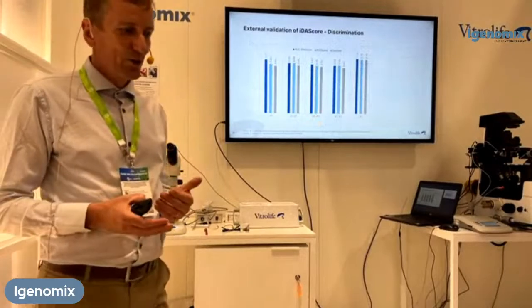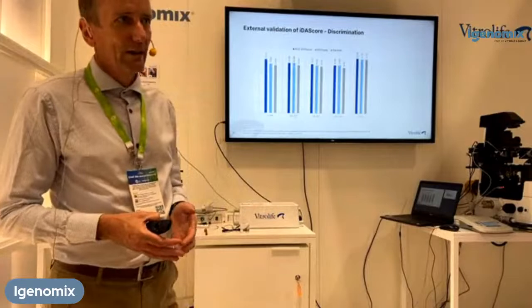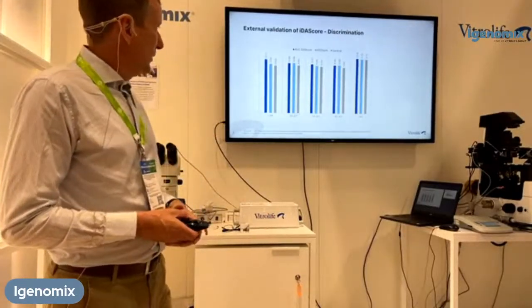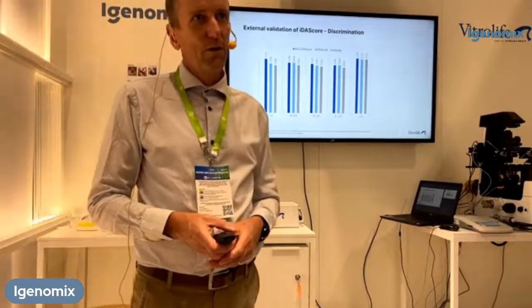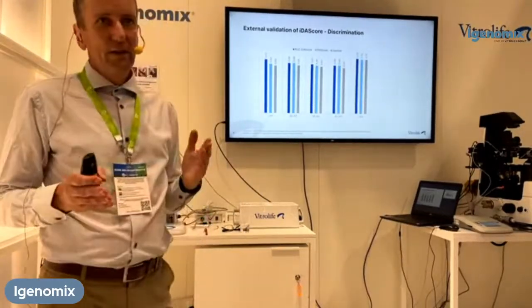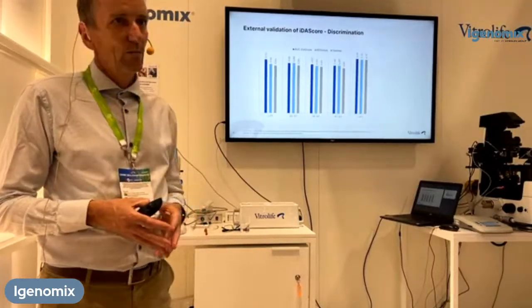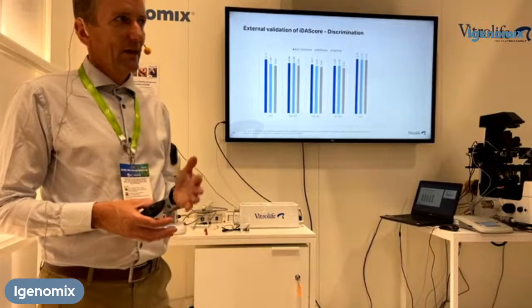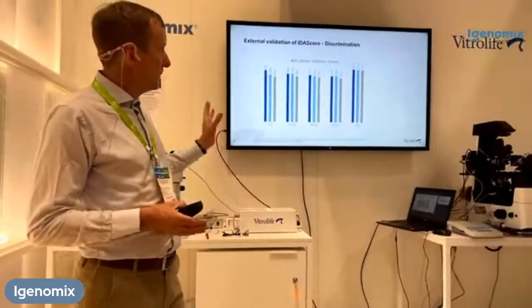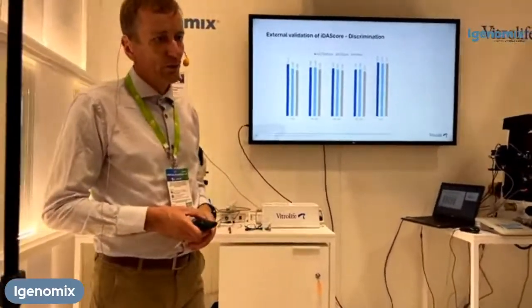So turning now to people that have used iDAScore in clinics. This is a very excellent study by Ueno and co-authors from Japan. What they have here is 3,000 transferred embryos, single embryo transfers, and then they took these 3,000 embryos and grouped them according to different ages.